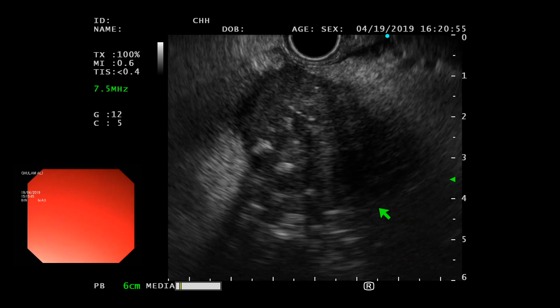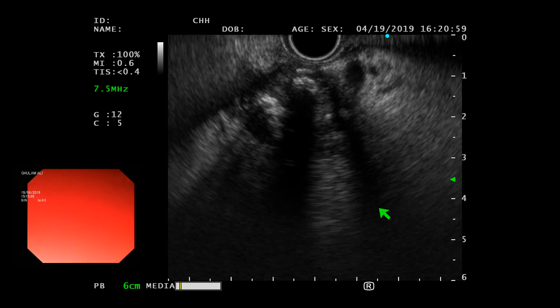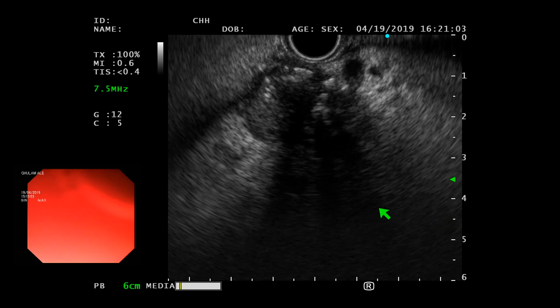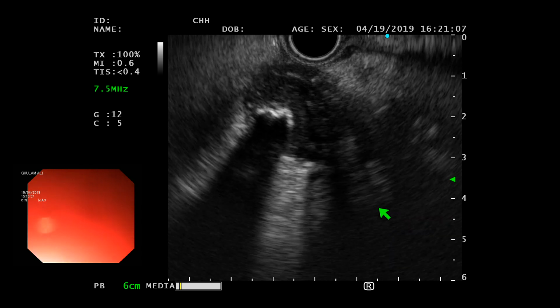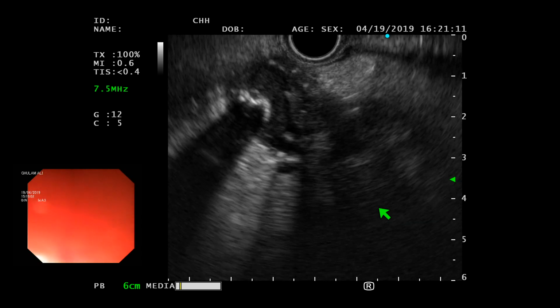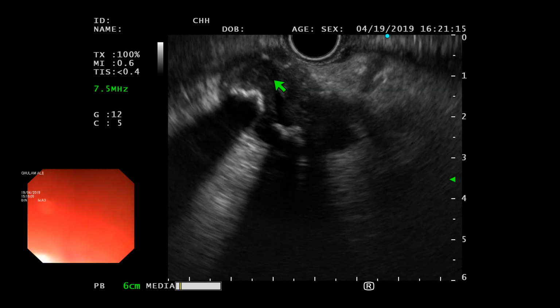Is this whole head heterogeneous? No, this is not, but you see here, I'm calling this more chronic pancreatitis because it's a little atrophied and it's all calcification there. This is all calcification there, okay? And these are some areas of necrosis. I can appreciate that very easily, that this here is necrosis. This is not the mass, okay?